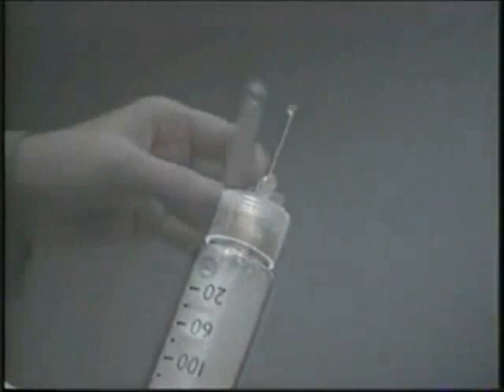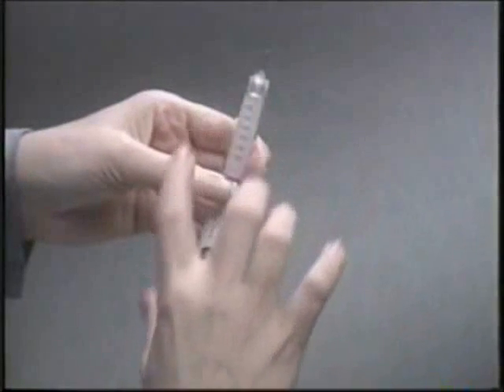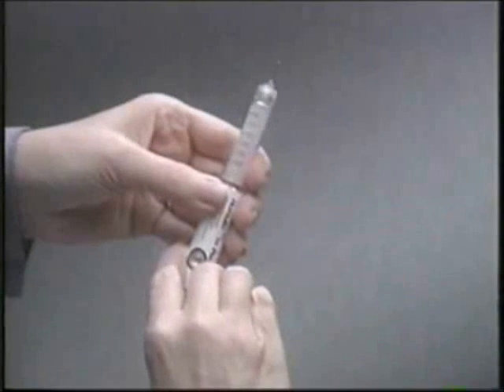If you don't, you need to repeat these steps until you see that drop.